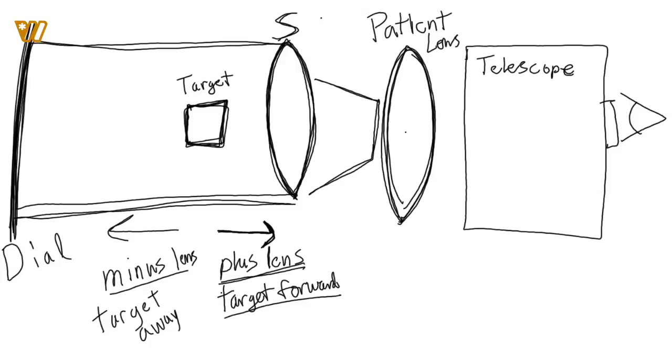So if you guys look in your text, down here below, you're going to see an equation. The equation is x equals f squared FV. That's going to be the lensometry equation. And so this is the mathematical way to figure out the patient's prescription, their back vertex power, based only on how much you move the target and what the standard lens power is, okay?